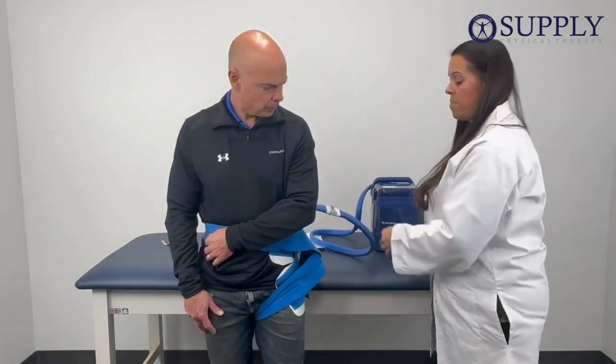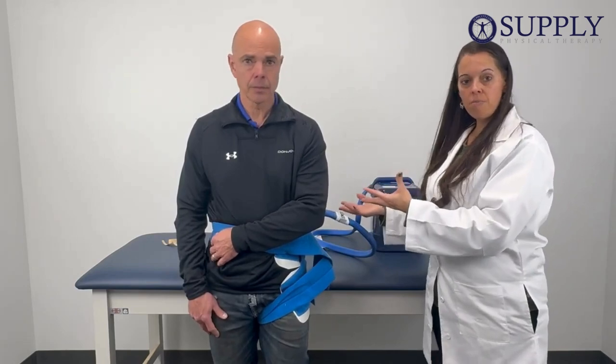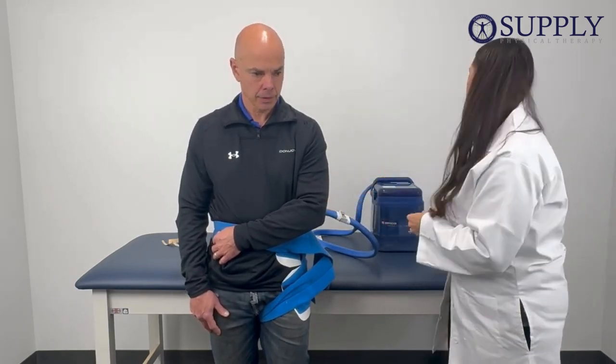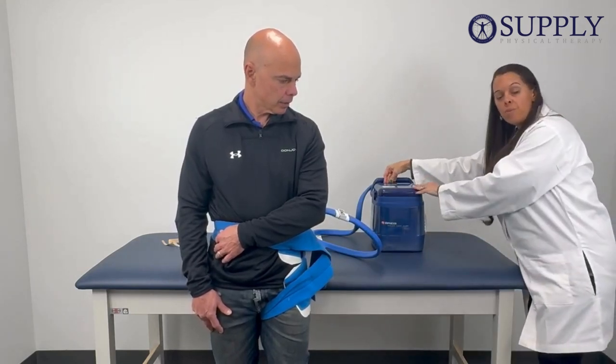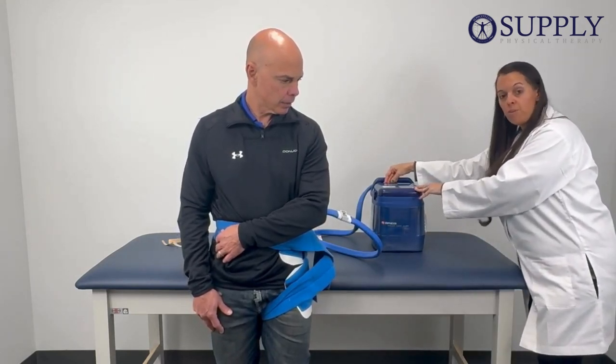Once we've done that, allow the patient to get comfortable if they're going to sit in a chair or lie on the bed. Take your power supply, plug it into the back of the lid on the cooler, then plug it into the wall, and you're ready to go.